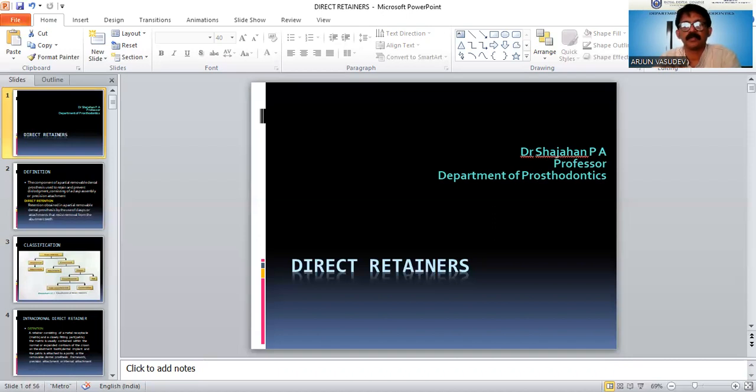Here in the second picture B, you can see the bar clasp, how the clasp is approaching from gingival. So it engages gingival. So the exhibition of the clasp components is very less externally. That is why bar clasp is considered as more aesthetic than the simple circumferential clasp.